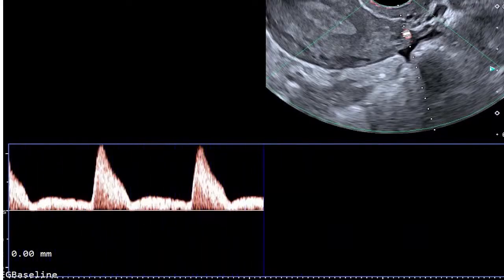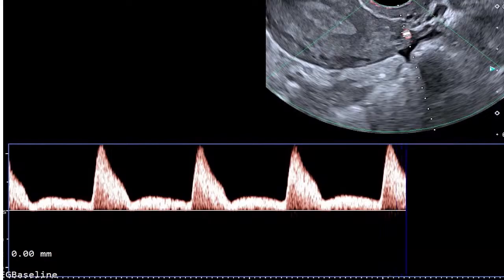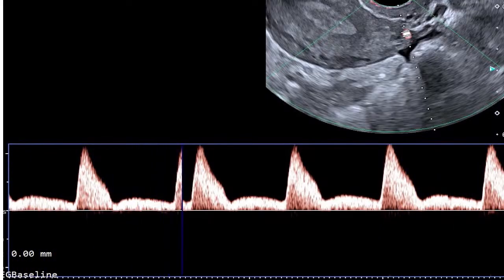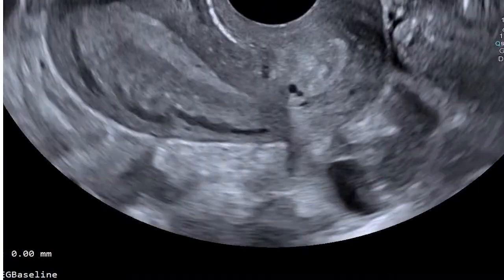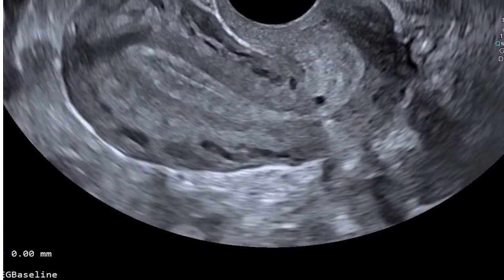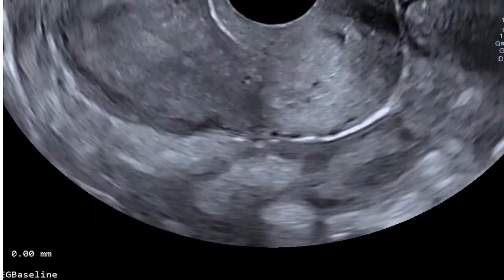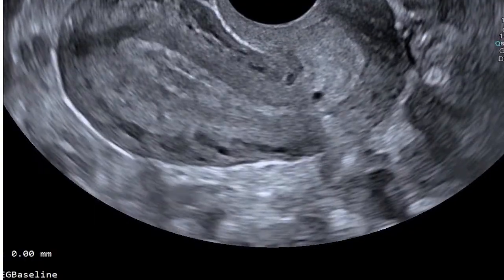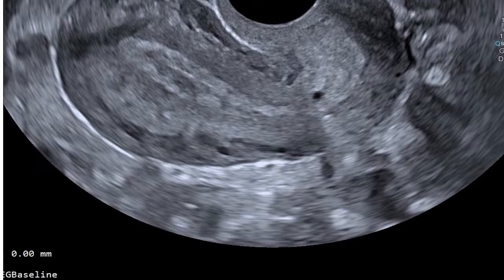So the problem that we have, or that people have: why does a healthy embryo sometimes fail to implant? The answer might not be the embryo at all, but a sudden issue with your uterine artery flow. So today we are diving deep into how uterine artery Doppler technology can unlock the secrets of your endometrial receptivity and finally bridge the gap between infertility and a successful pregnancy.